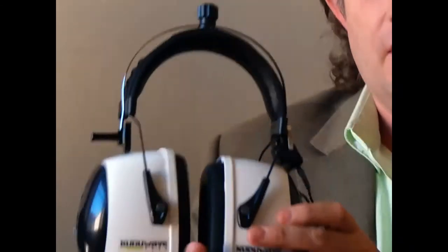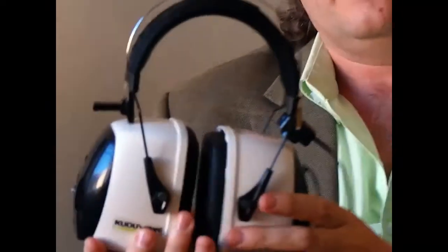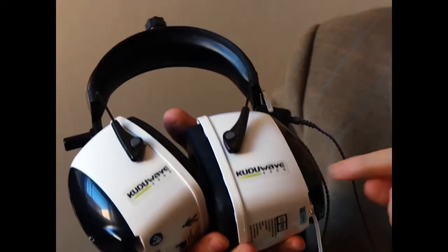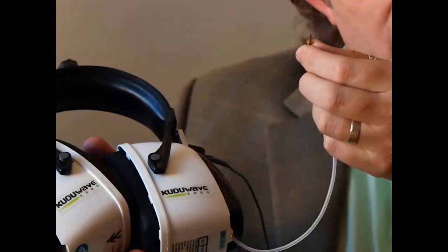Unlike traditional audiometers, the KUDUwave has got the audiometer, the headset and the speakers all in one. Inside each KUDUwave there's electronics. That is the audiometer. Built in there's an insert earphone, a little speaker inside the KUDUwave that plays the sound through this tube into someone's ear.